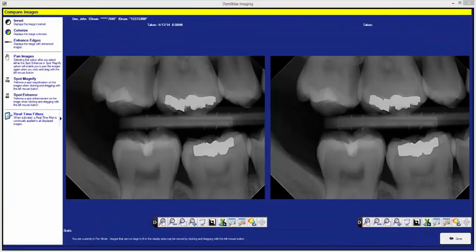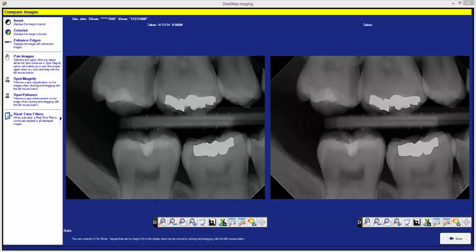Once we have clicked the OK button we now have both x-rays pulled up alongside each other when we can compare the x-rays up for diagnostic use or if you need to show them to a patient for patient education.